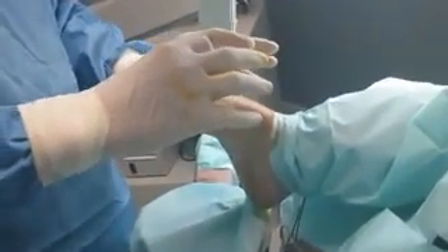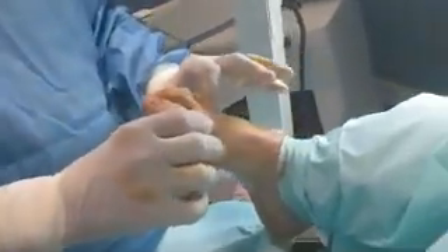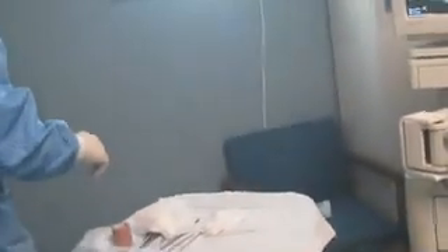Another thing that allows me to know that I can probably get by with a decompression here is if you look at her metatarsal parabola. You can see her third and fourth mets are not long. A lot of these patients with neuromas will have a fairly long third and fourth metatarsal, and those patients you're going to have to address with an osteotomy of the third and fourth metatarsal. You can see her metatarsal parabola drops down fairly quickly here, so she doesn't have a long third or fourth metatarsal.